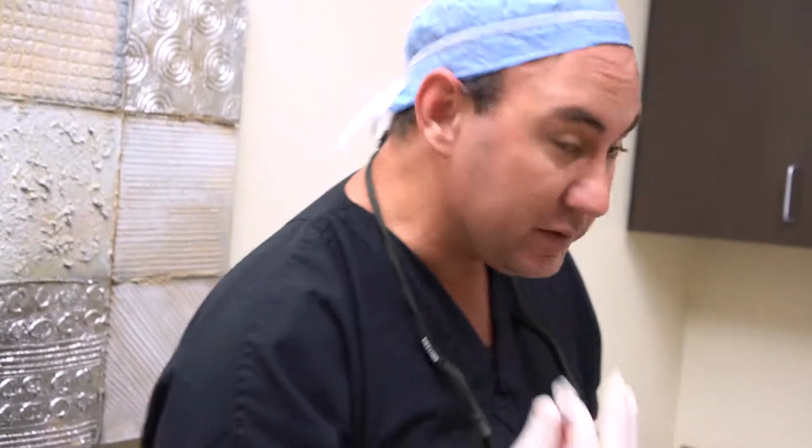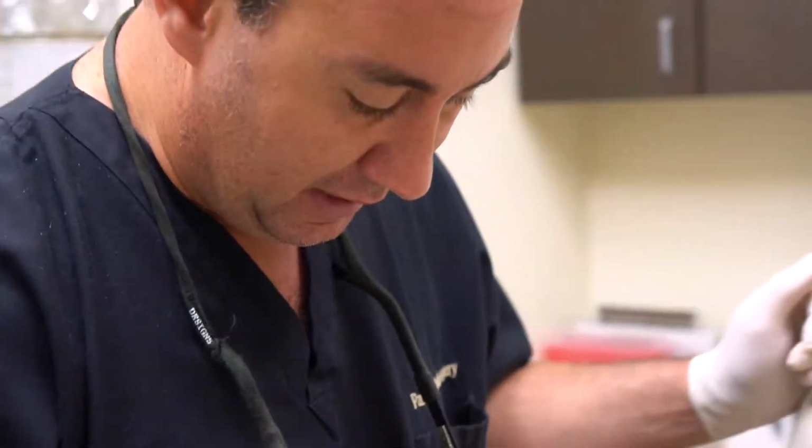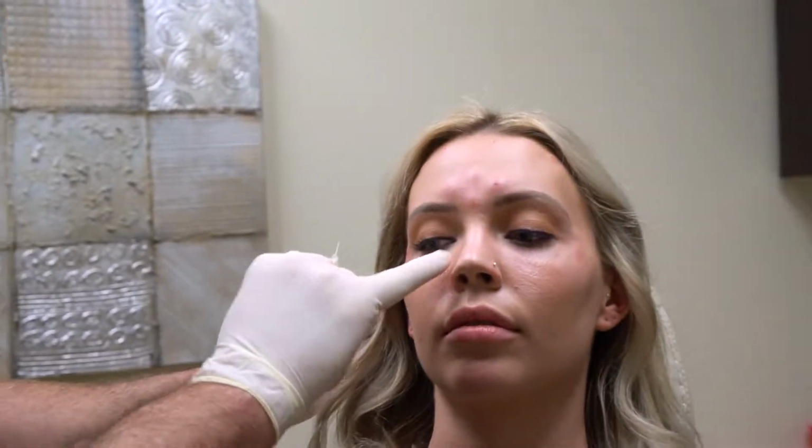We do lips with Volbella, but it's one that you really don't have that stiff cardboard feeling like. So it's great for under the eyes and other places. This, of course, is an off-label indication. There's no indication for under eyes with Volbella. So I like it when I'm doing the tear trough. And in her, we're going to put a couple, let's have a couple of those ready.